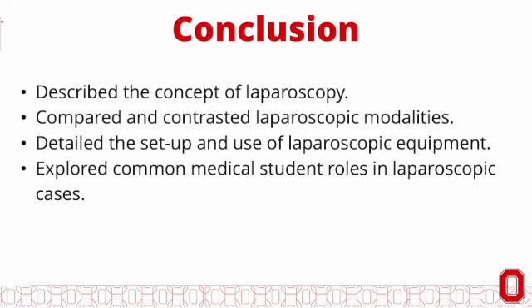To recap, in this video we have described the concept of laparoscopy, compared its major modalities, detailed the setup and use of laparoscopic equipment, as well as explored common medical student roles in laparoscopic cases.